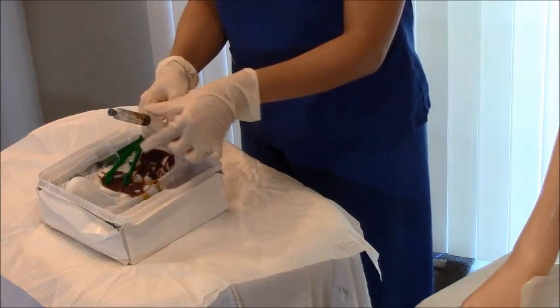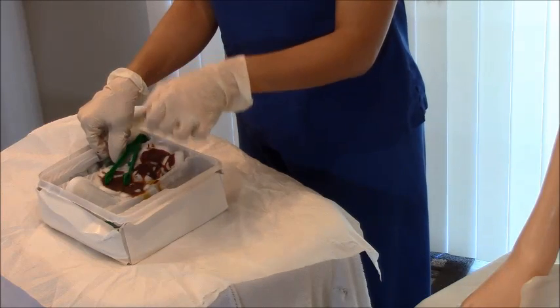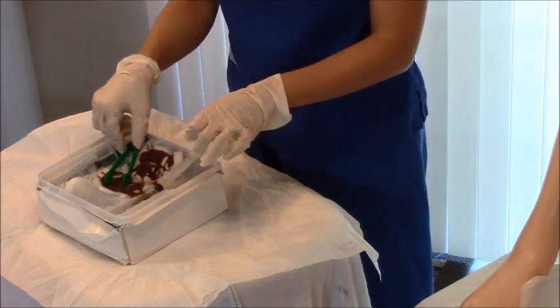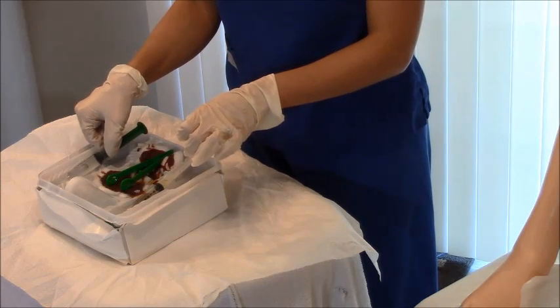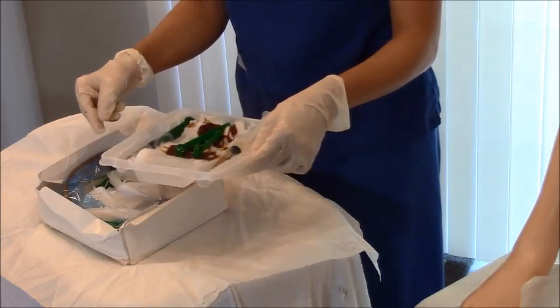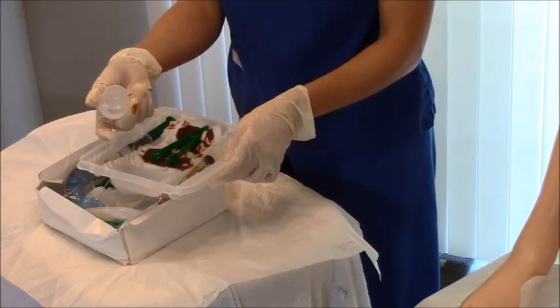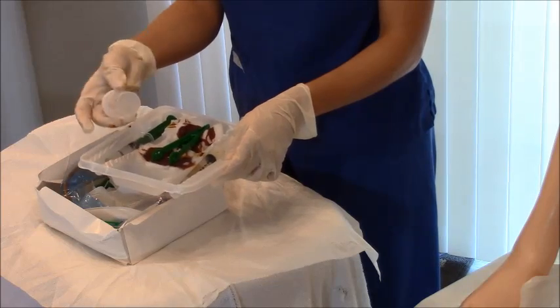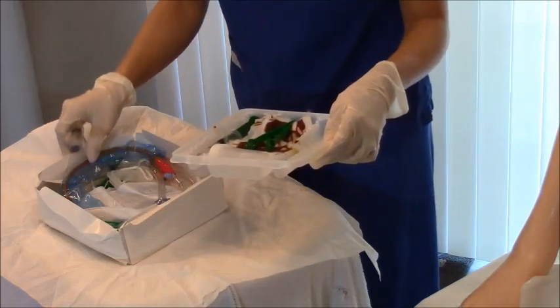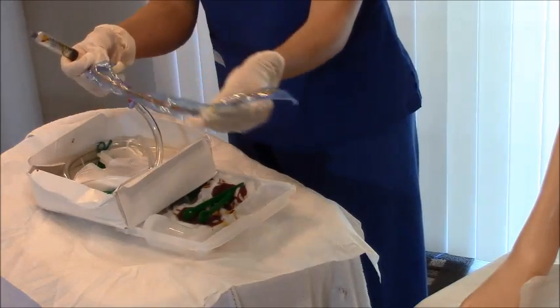Next you have your sterile water to inject into the bulb of the Foley catheter — you always want to make sure the bulb works before insertion. I once had a bulb that didn't work and had to get an entirely new catheter kit. You also have lubricant to lubricate the catheter, and a specimen container in case the doctor wants a urine sample. To check the bulb, get your catheter out of its protective cover, connect the syringe to the inflation port, and inflate.